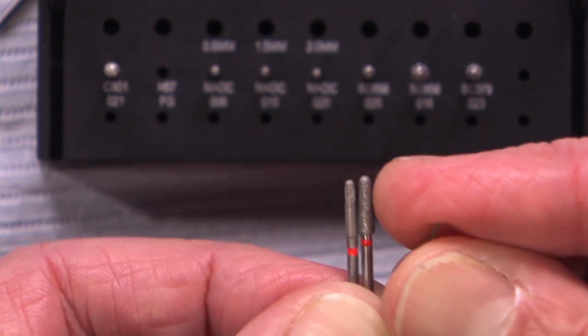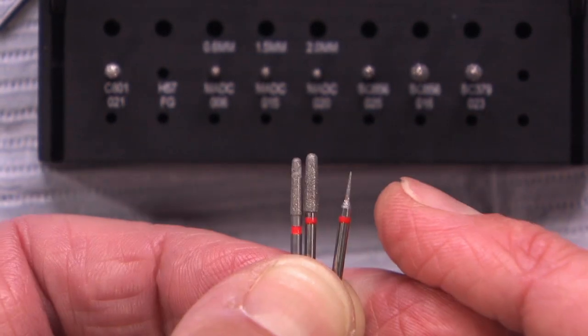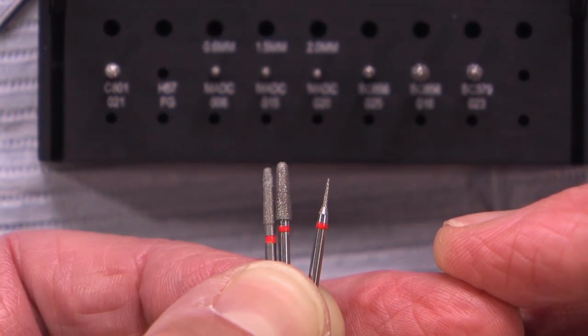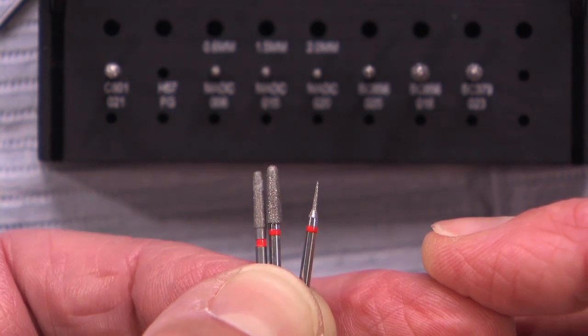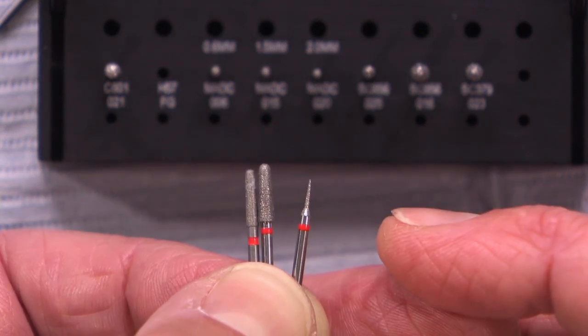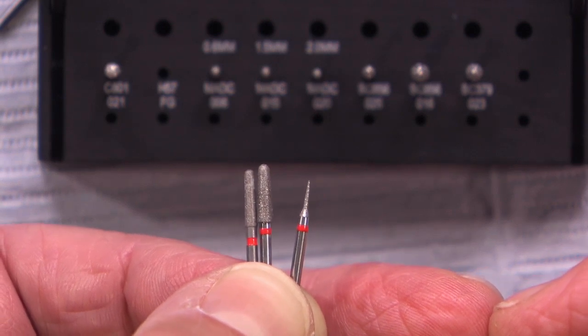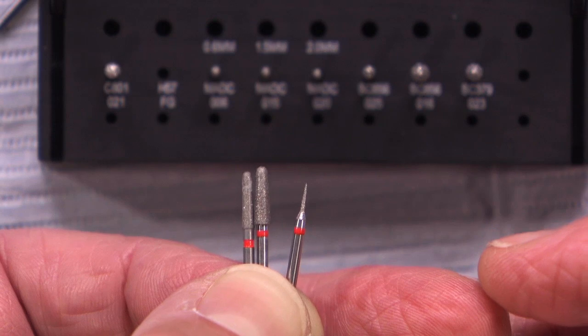And the last one that I use sometimes is a 392016. We just kind of call this a mosquito burr. The proper name's a 392016 burr. This is for when you're prepping teeth, and it typically happens in the posterior, and you've placed your margin, but there's still not enough separation between the tooth you're working on and the one next to it. You can barely get retraction cord, if at all.